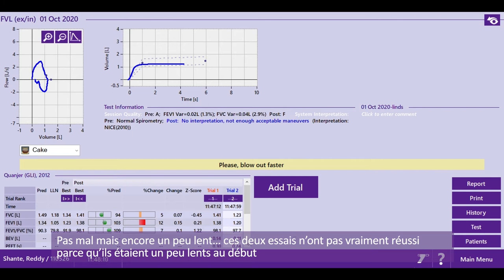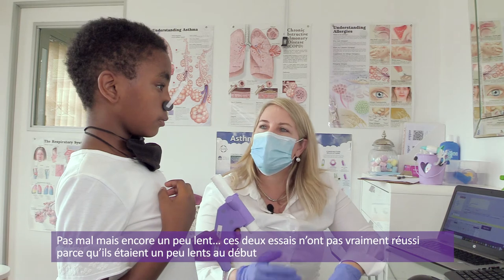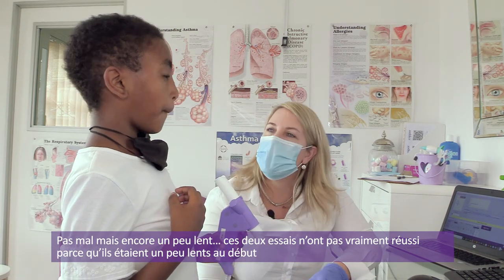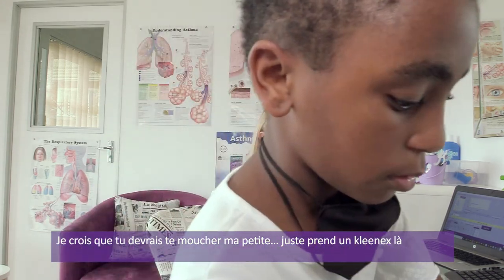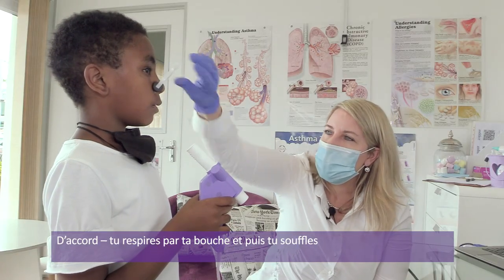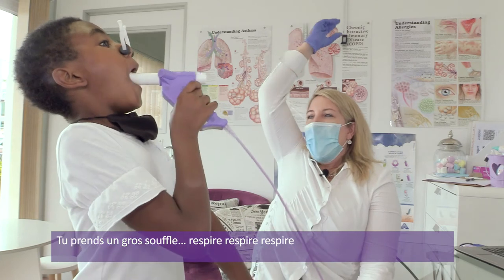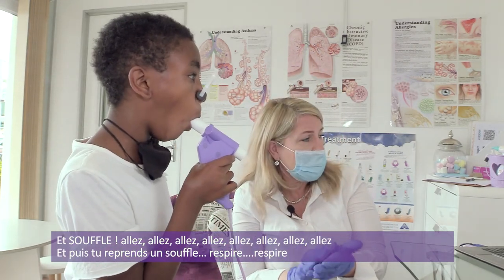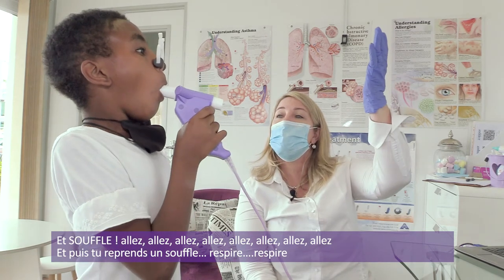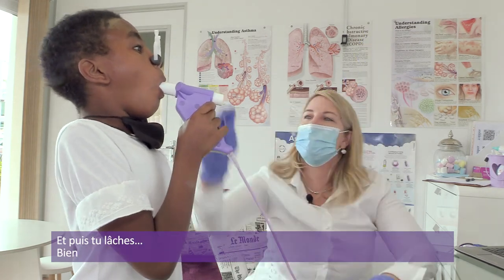So if you look at this, both of these ones didn't work too well because they were a little bit slow at the beginning. I think you need to just blow your nose, my girl. Just take a tissue. Try and breathe in through your mouth, and then you're going to blow. Okay, big one, big. Big breath in. In. And relax. Good. Okay.